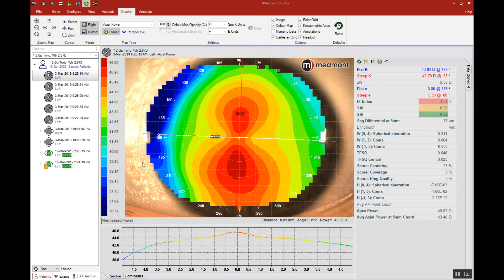In rare cases the Medmont software may not be able to define the pupil. This can periodically happen when you have an incredibly dark iris that makes it difficult for the software to determine the border between the pixelation of the pupil, the very dark pupil, and the very dark iris.